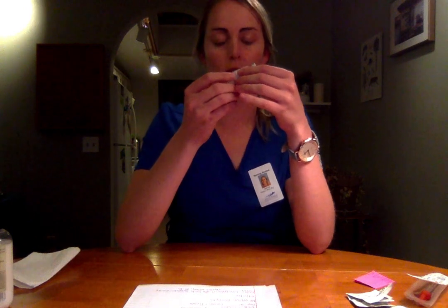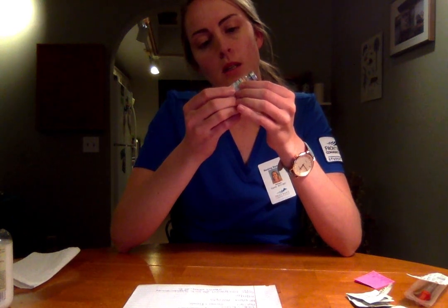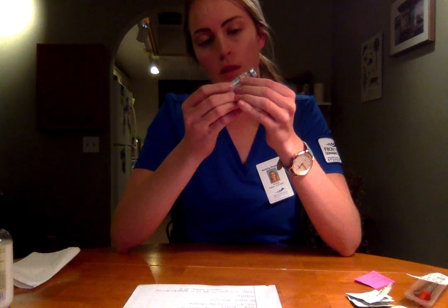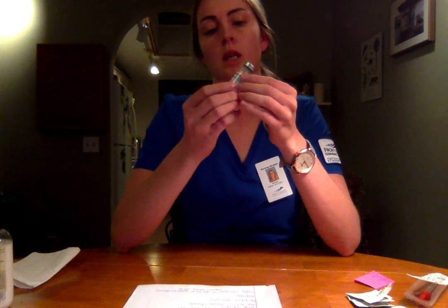Alright, I'm going to check the dates to make sure the vial is not expired. If it was expired, then I will throw it out. Okay, so the factory expiration date is May 2027, so that is good. The written expiration date, so this vial was previously opened, and the date here is 30 days away from when the vial was originally opened, and that new expiration date is May 9th, 2020, so it is not expired. Now I'm going to perform my 6 rights.